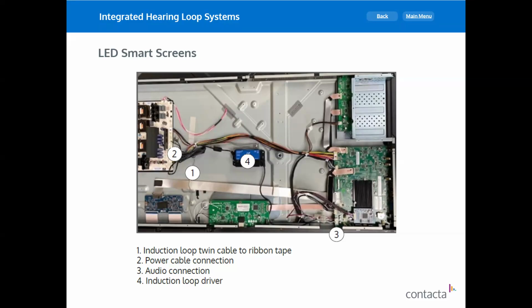There isn't an adjustment to this system as you have in a large area loop. So obviously you're going to hear louder if you are sticking your head right by the screen, and as you go out, the sound level reduces. But it was more than compliant with the IEC standard, because the IEC standard tells you to measure in 3 locations and 3 heights, in average of 1.45 meters, and it met the standards without a problem.